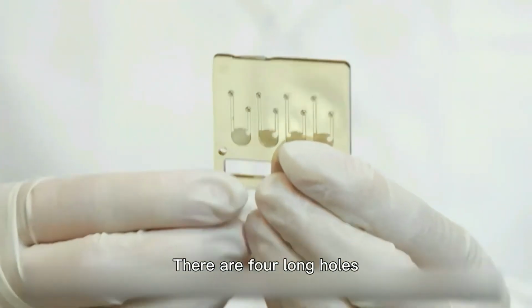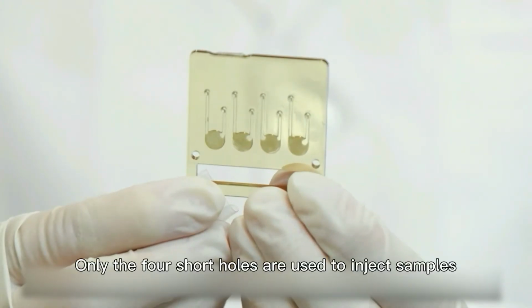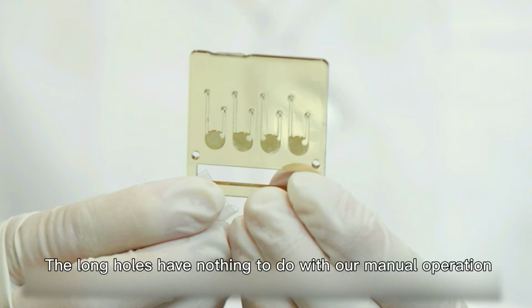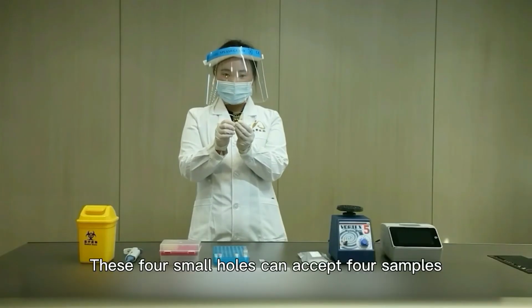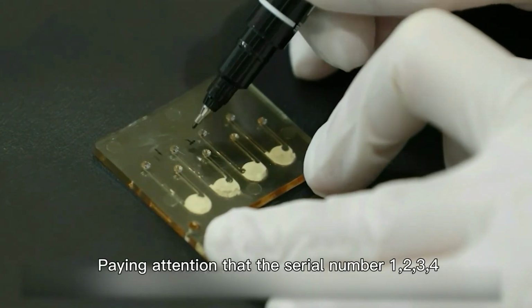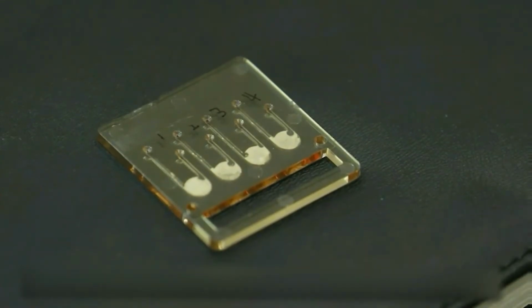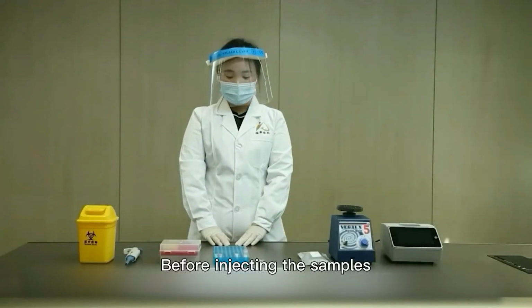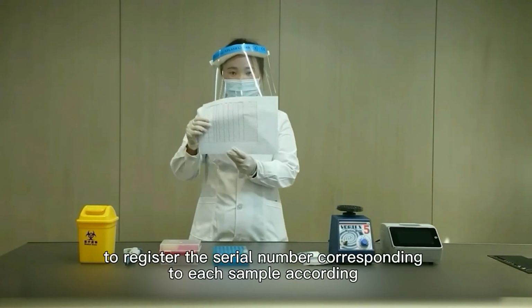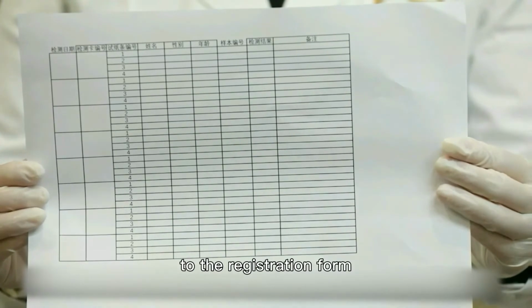There are 4 long holes and 4 short holes on the chip. Only the 4 short holes are used for injecting samples. The long holes have nothing to do with our manual operation. These 4 small holes can accept 4 samples. Pay attention that the serial numbers 1, 2, 3, 4 are clearly marked on the chip. Before injecting the samples, it's quite important to register the serial number corresponding to each sample according to the registration form. Please don't skip it.